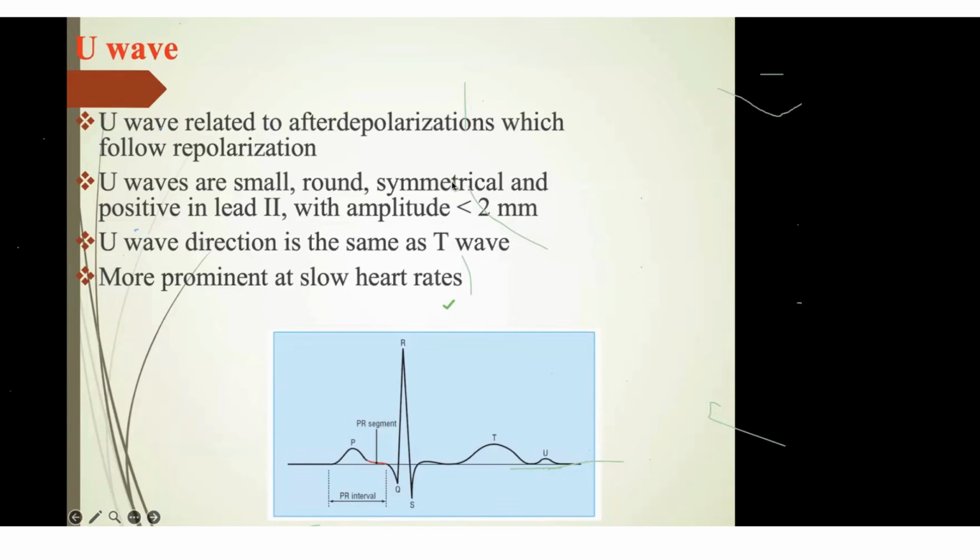Another question is how to differentiate new and old MI in ECG. How to differentiate new and old: presence of pathological Q waves, or a persistent ST elevation, a biphasic ST elevation, poor R-wave progression, Q waves in anterior leads in anterior wall MI, persistent Q waves in inferior leads in inferior wall MI, persistent deep T wave inversion.